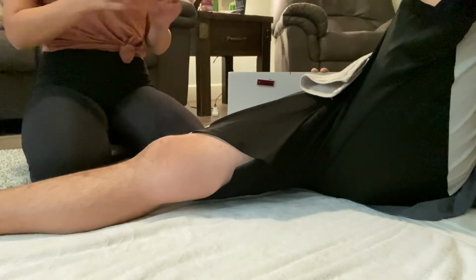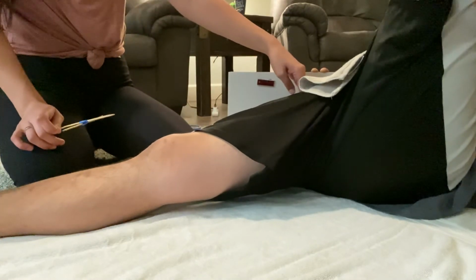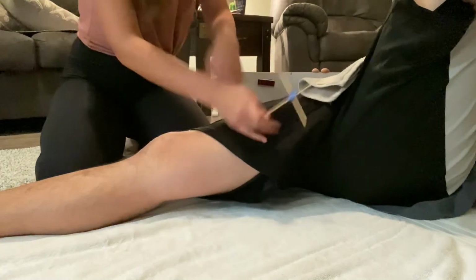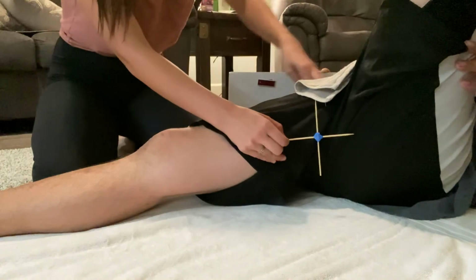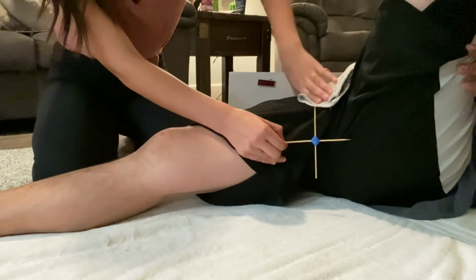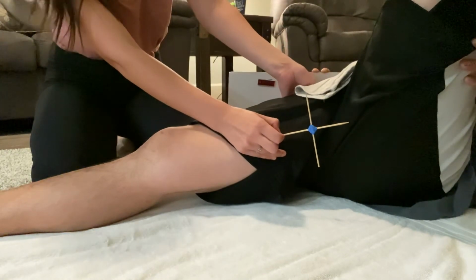and your central ray for this exam is going to be midline of the thigh, and it's going to be perpendicular to the long axis of the femoral neck. Again, using that localization method, it should be about right here. If the femoral neck is about here, we're centered to that, and then it should be centered to midline of the thigh. So we've got our top of IR in place, parallel to the femoral neck, and the greater trochanter is in center of the IR.